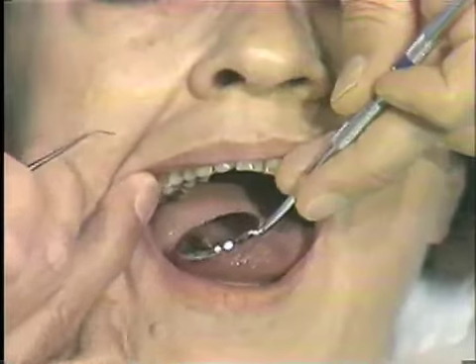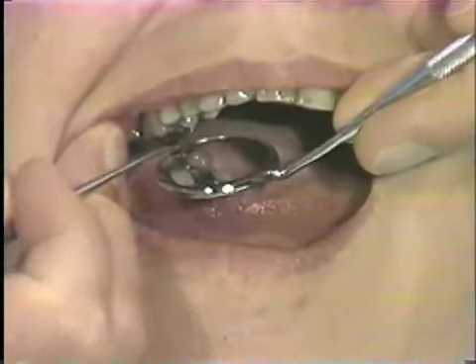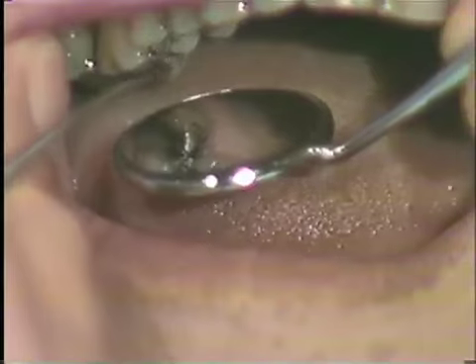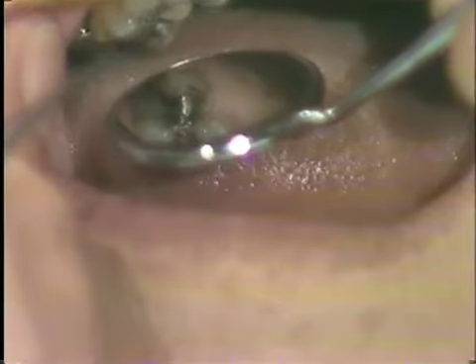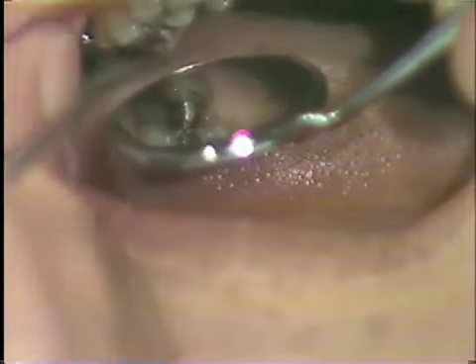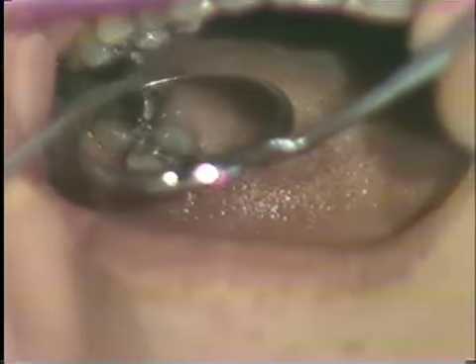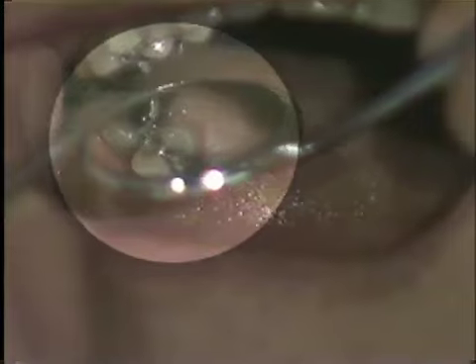Continuing the examination of the teeth, we're concerned about carious lesions and the condition of existing restorations. And we probe thoroughly the margins of all of the teeth. This examination procedure is best done when the teeth have been cleaned recently, following a prophylaxis, that is, and when the teeth are completely dried.